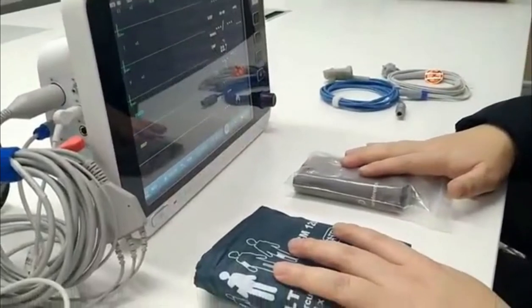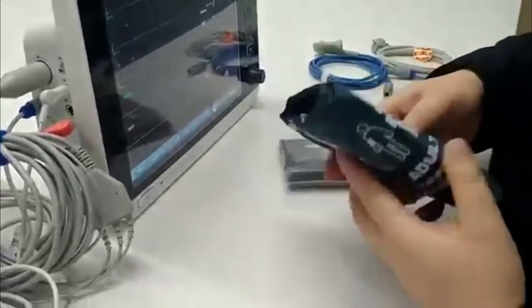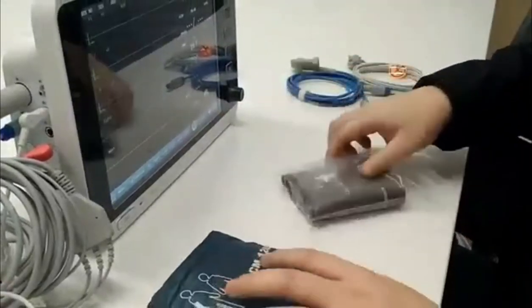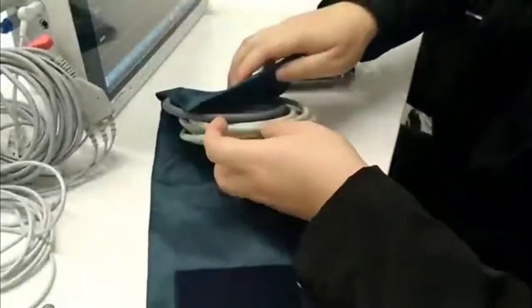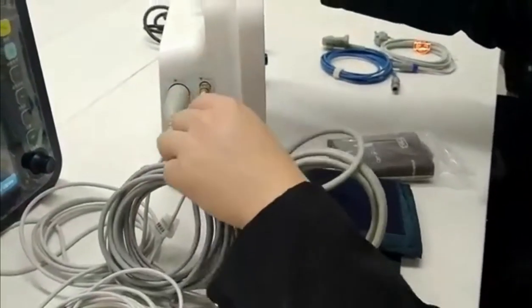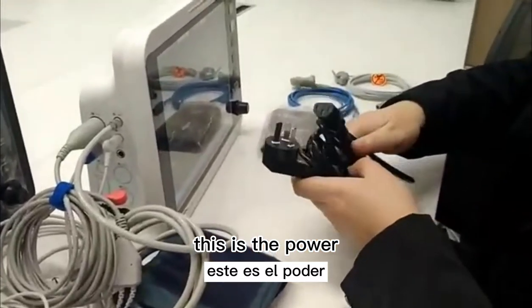This is the NIBP cuff. There are many different sizes. Normally this size is for adults, 25 to 35 cm. These smaller ones are for children, in various sizes. This is the power wire.